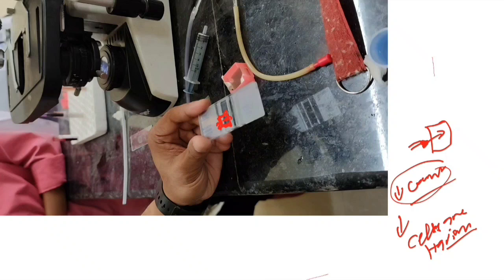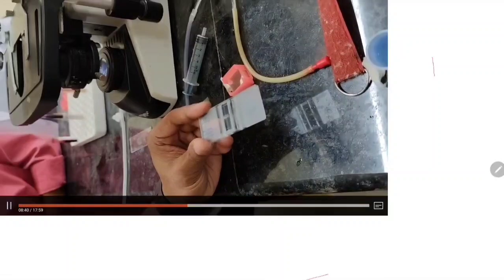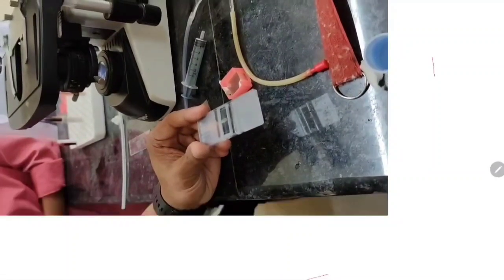Because of that, your count will be lower. So if overcharged, your count will be lower. Undercharged, obviously you are charging less, so the count will be lower. In both conditions your count will be lower. So let's move to the next part. I'm going to charge now.